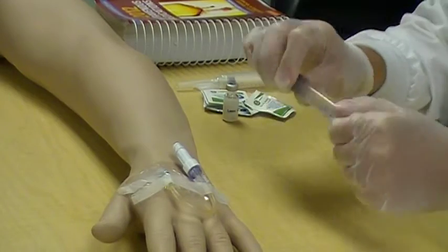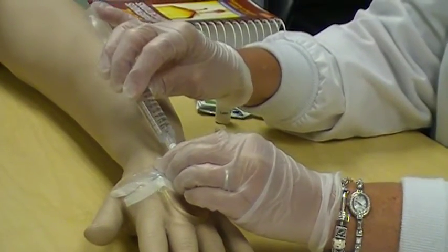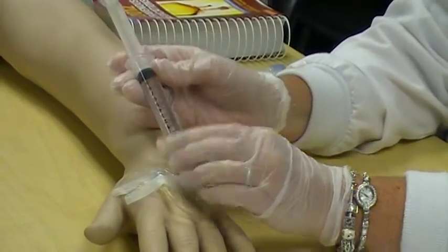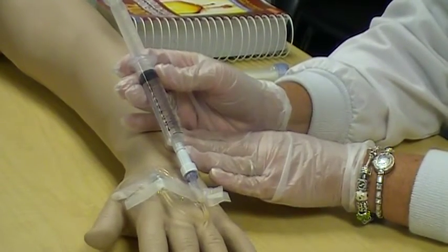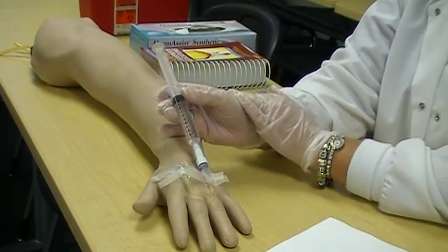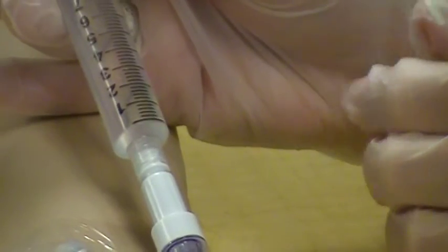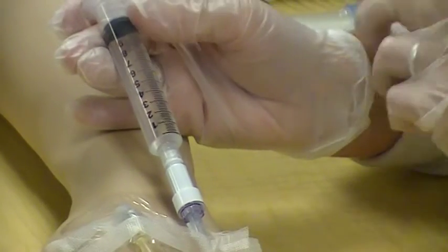So after we've cleaned, we're going to attach our saline flush. And again, this can either be a prepared one, as I have here, or in some facilities you may have to actually draw up the medication or the saline from the vial itself into a syringe. This one's a prepared one.